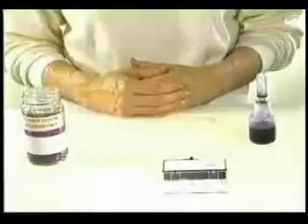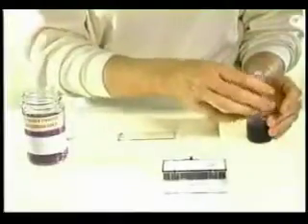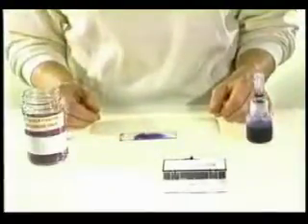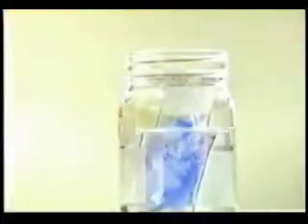Toluidine blue is very easy to use. After fixing the slide in 95% ethanol for about one minute, the slide is retrieved and placed on absorbent paper. One or two drops of the stain is placed on the smear and a cover slip is placed on top. I let the stain penetrate for about 15 seconds before removing excess stain by turning the slide and pressing gently. After wiping the bottom dry, the sample is ready for examination. After evaluation, the slide is returned to the alcohol container. The cover slip will fall off and the stain will dissolve. The slide will be restained with Papanicolaou for final evaluation.